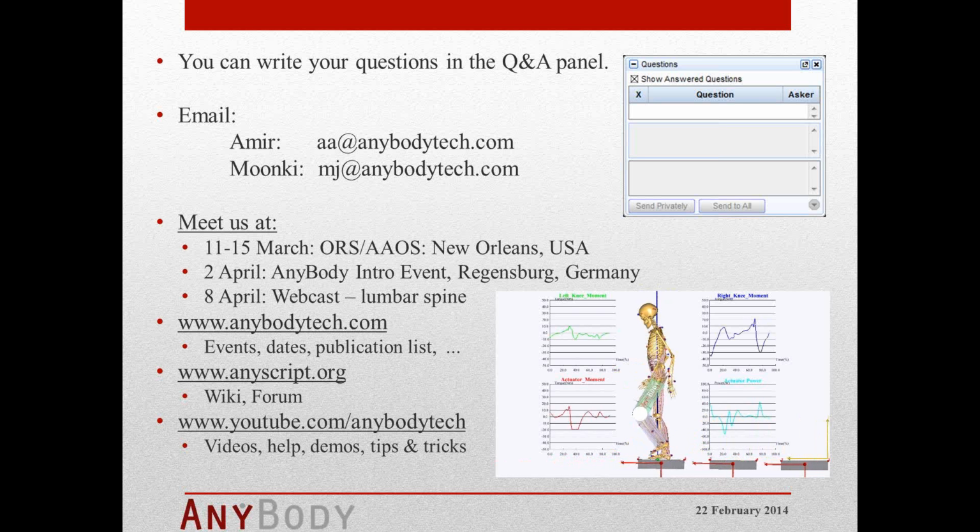And that will make it a lot easier and quicker in your development process of the exoskeletons. If you have the exoskeleton already and then have the measured ground reaction forces, you can use them, of course, as well. But on the other hand, even if you want to do slight changes in an exoskeleton, it can go a lot quicker without any measurements itself.